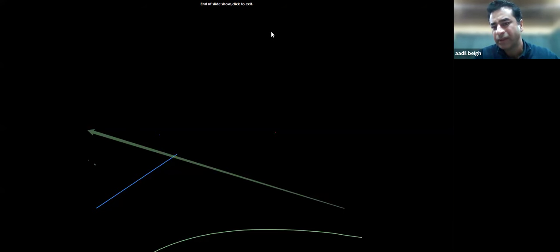Any characteristics on Doppler that will tell this thrombosis will be treated? Beyond the thrombosis, there will be a stenosis. If there is a stenosis, you give the thrombolytic agent and go for correction of the stenosis also. That way you can treat the thrombosis. How do you differentiate between stenosis and thrombosis? On ultrasound, you can see the thrombosis.